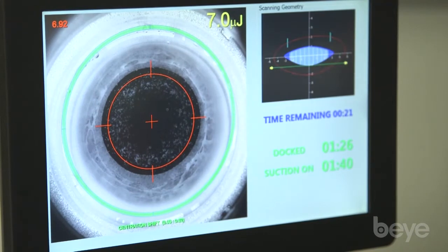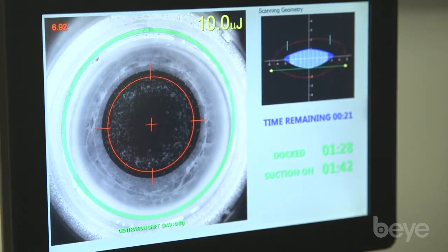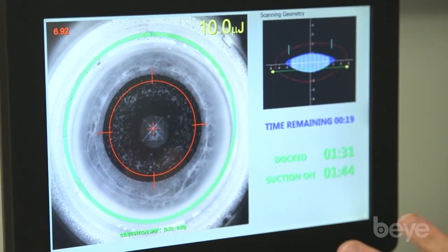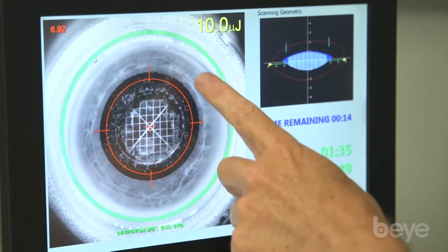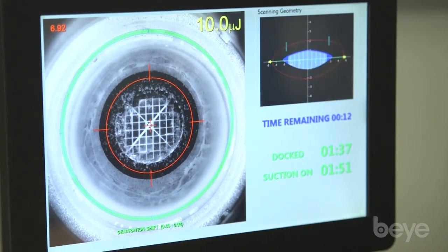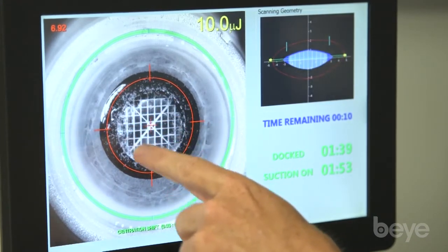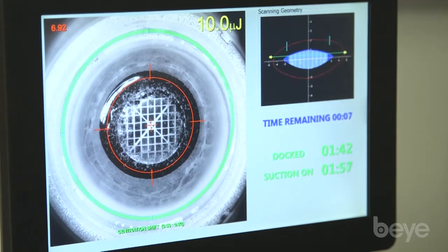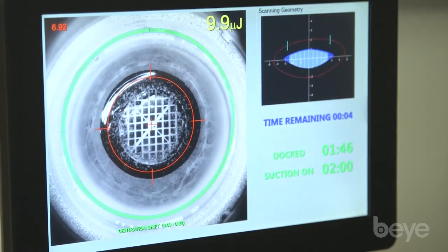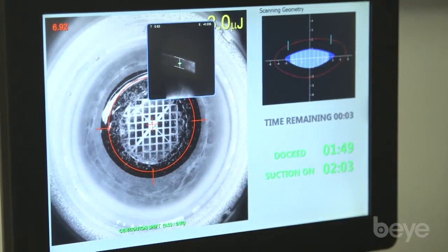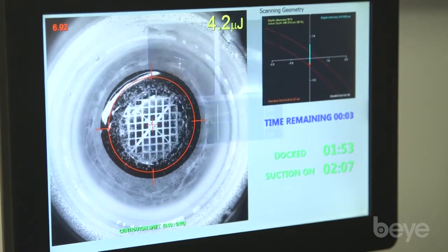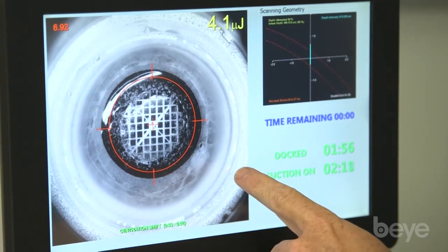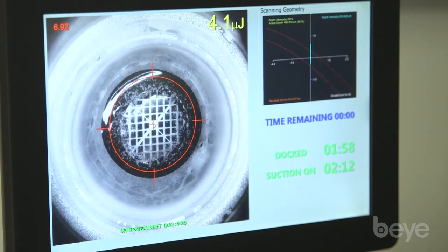The laser's working. So you see — quickly we did a capsulorrhexis. Now we have the grade 3 or category 3 cataract fragmentation treatment, which is 2 cuts, and then we have the kind of cube or matrix pattern around that. It's just the nucleus that gets treated — just the dense area. Now we're going to remeasure the cornea for the arcuate incision, which is put down right there, and the treatment's complete.